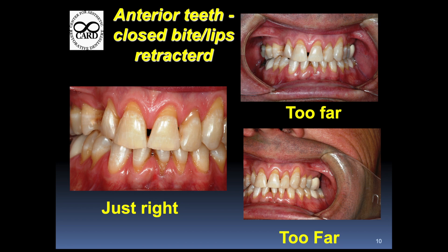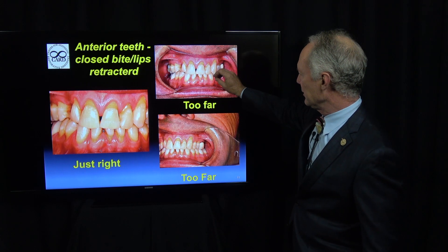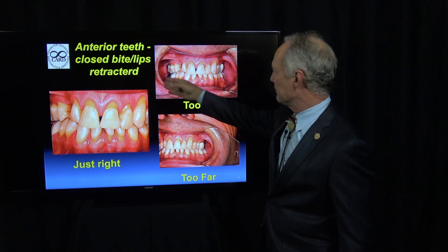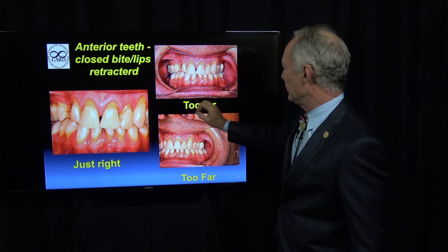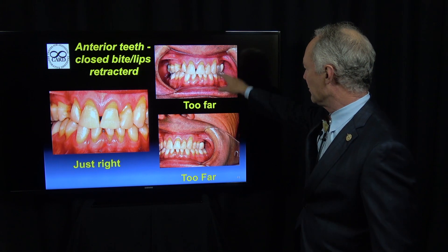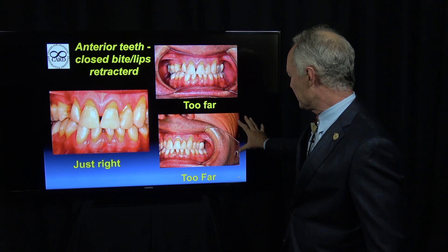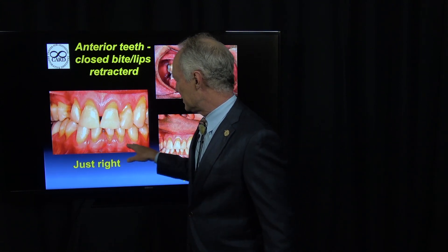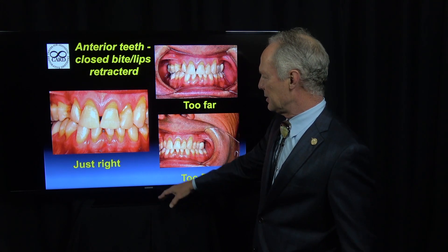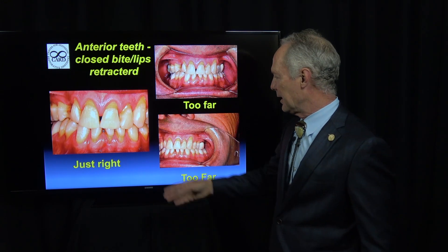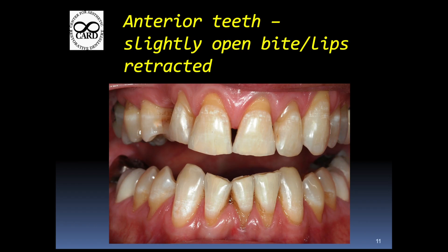For the anterior teeth closed bite with lips retracted — so the lips are retracted and the teeth are together. Too far away is distracting to the patient if they see the retractors or a lot of gum tissue — you just want to see the teeth. This is just right: back to about the bicuspids on each side, not a lot of lips, no nose or chin. Take a lot of the gingival tissue away, just enough to show the attached gingiva and the non-keratinized gingiva. For the anterior teeth slightly open with lips retracted, this is just right.